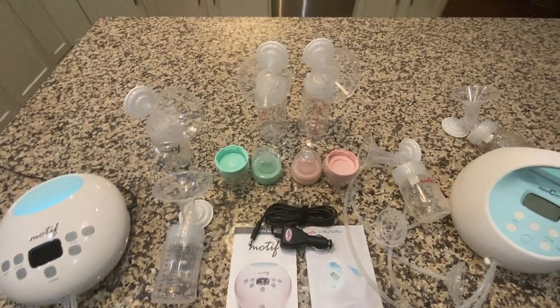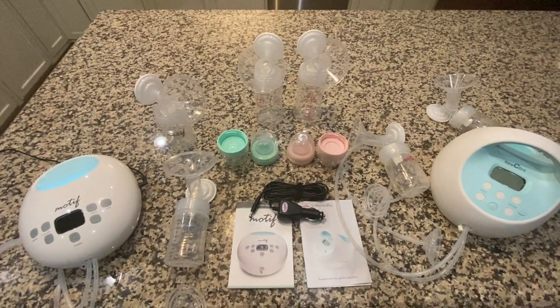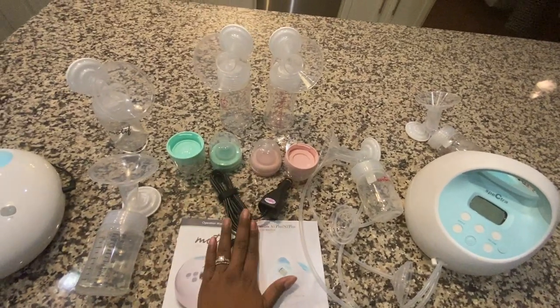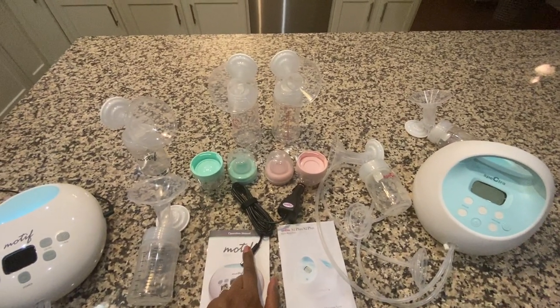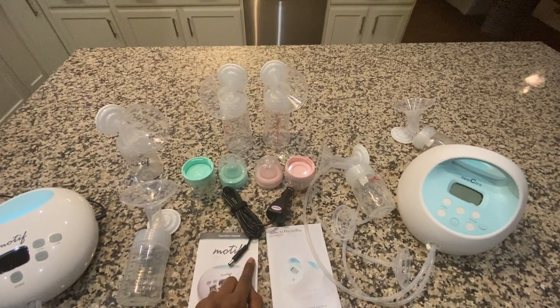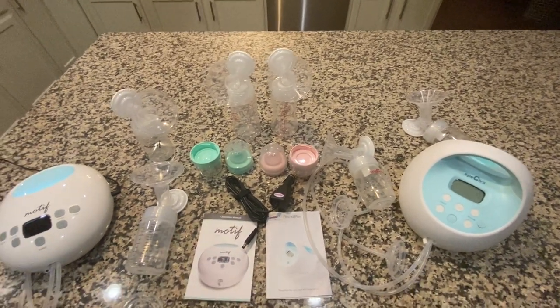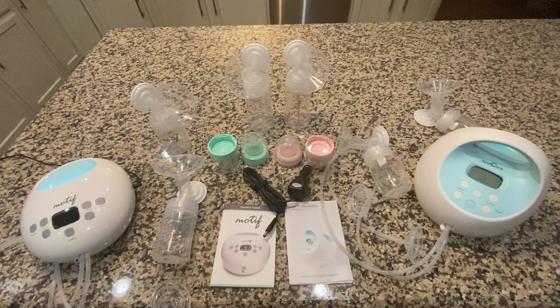In terms of out-of-pocket cost, the Motif Luna is $189.99 on Amazon and the Spectra S1 is $199.99, so that's a $10 difference. I also bought a Spectra car charger for about $9.99, and since the pieces are interchangeable I can use it with the Motif Luna as well. I didn't check whether Motif Medical offers their own car charger, so I can't compare that price.